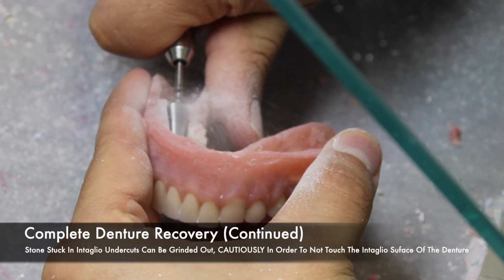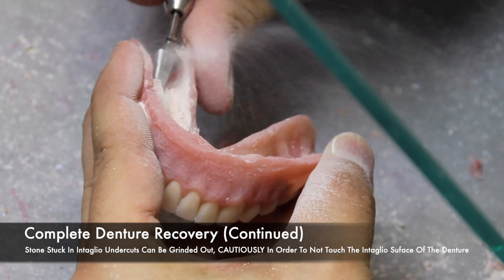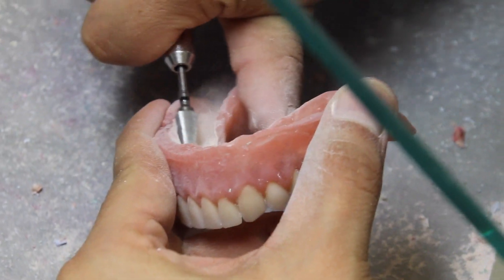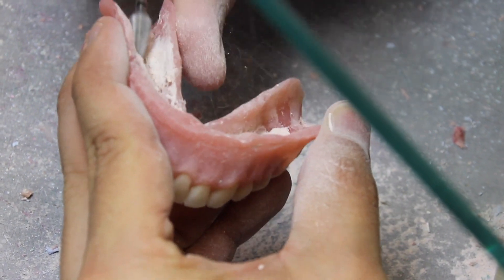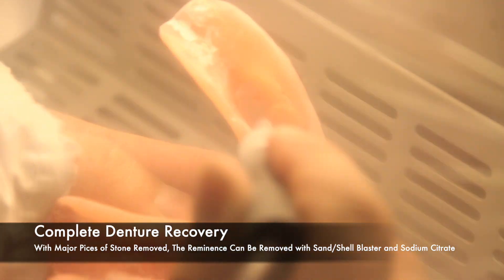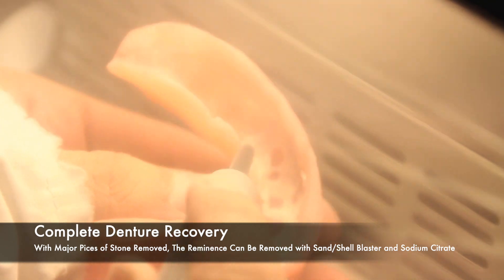Getting back to denture recovery, if a pneumatic chisel was not used and there are large pieces of stone left inside the intaglio surface of the denture, use a carbide burr to remove the bulk of it. Do this cautiously — you cannot touch the intaglio surface of the denture because it will result in an ill fit. With the majority of the stone removed with a burr, the remnants can be removed with a sand or shell blaster or the use of sodium citrate solutions. A sand blaster is not recommended, but a shell blaster uses walnut shells which are easier on acrylic surfaces.